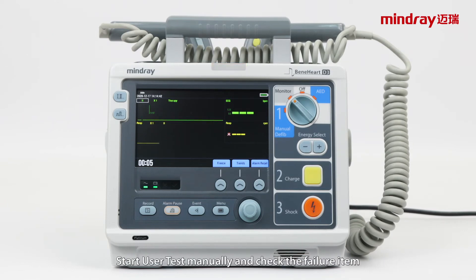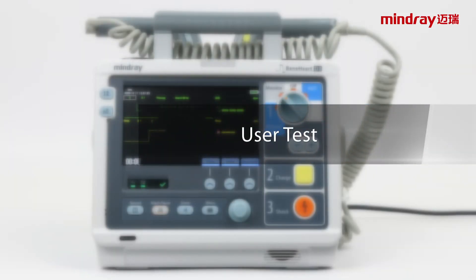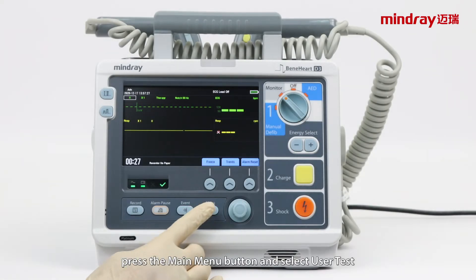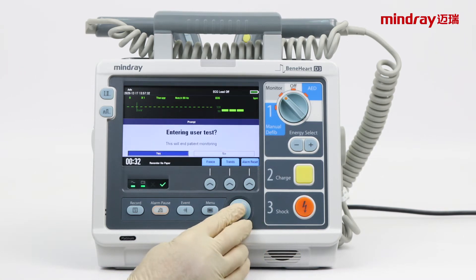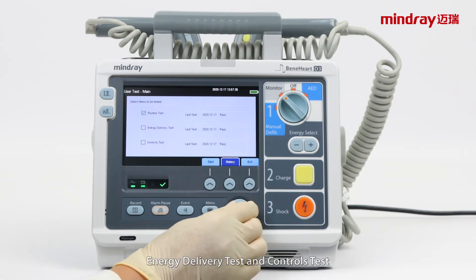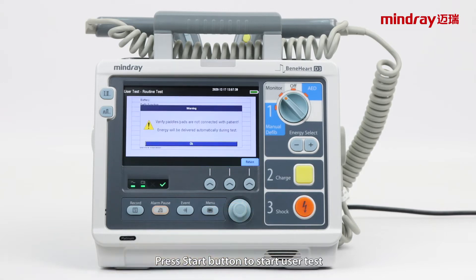Start user test manually and check the failure item. To access user test, press the main menu button and select user test. Select routine test, energy delivery test, and controls test. Press the start button to start user test.